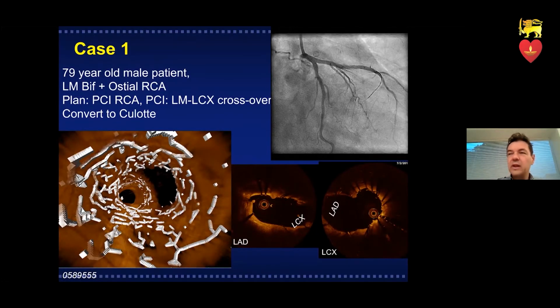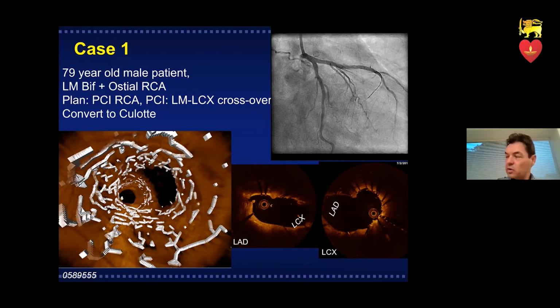Do you then routinely inflate the side branch balloon, or just in case of occlusion of the side branch? Yes, only in an occlusion situation you open up the jail balloon. Otherwise, you don't open up. You just leave it there. The smallest balloon you use. You use the smallest balloon. Rewire before you pull the balloon. And how much resistance do you have on it when you pull the balloon?